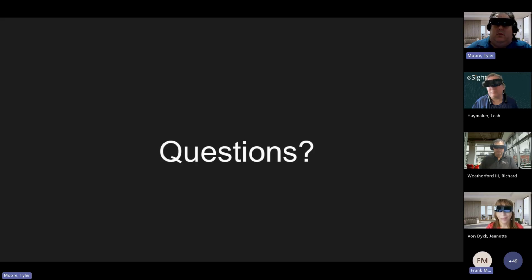Okay, and then to check that, I check on the eSight app and settings. No, you would go into your unit itself. You can check if the software is up to date. So not the app, but in your settings menu, you would check there. So it would say 5.2.7 for your software version.